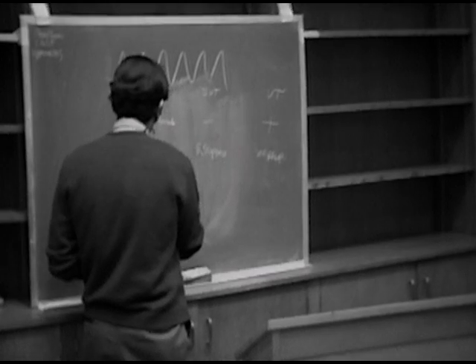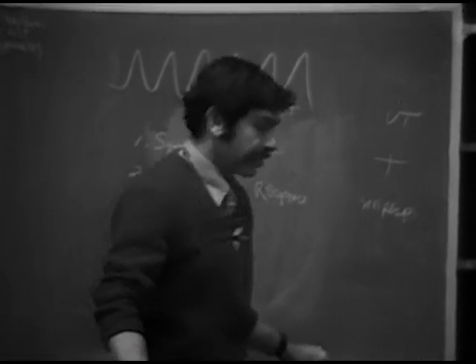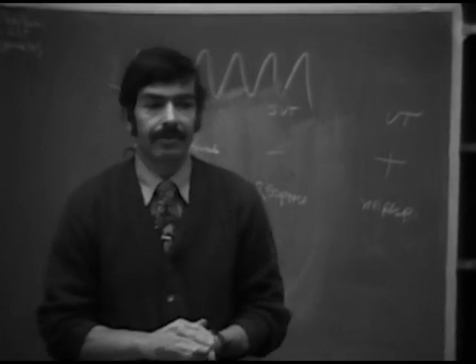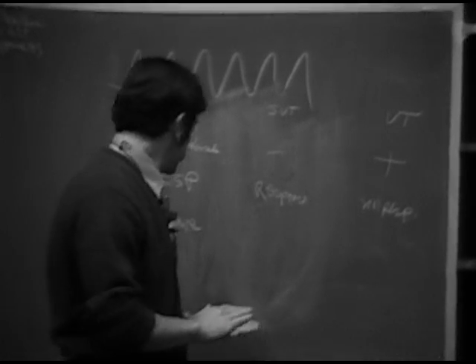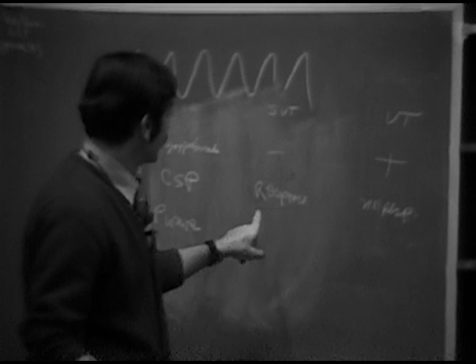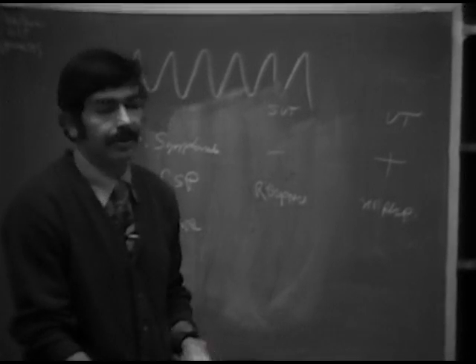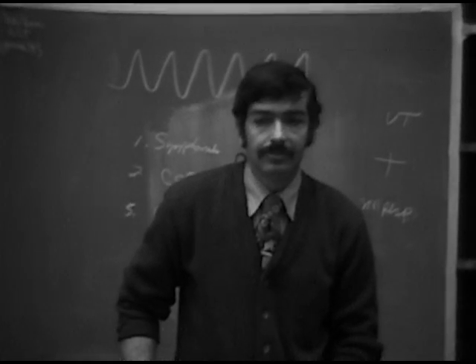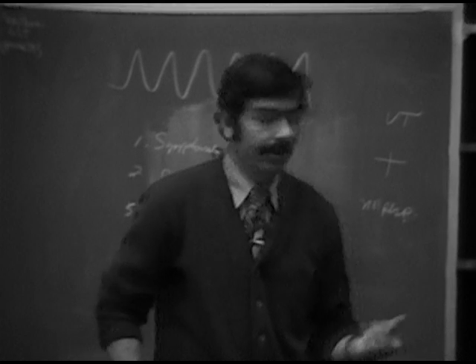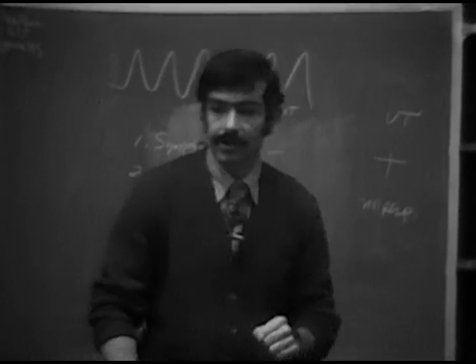So let's say that we find P waves in the electrocardiogram and can ascertain their relationship to the QRS complex. Now, if the ventricular rate is greater than the atrial rate, what are we dealing with, most likely? It's AV dissociation, and in this case, it would be most likely a ventricular tachycardia.